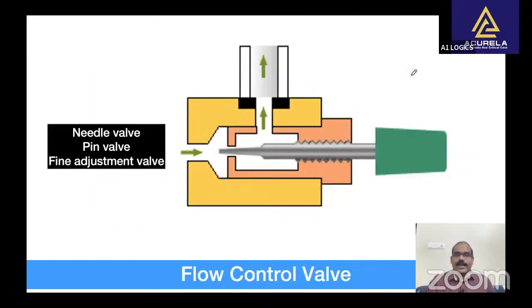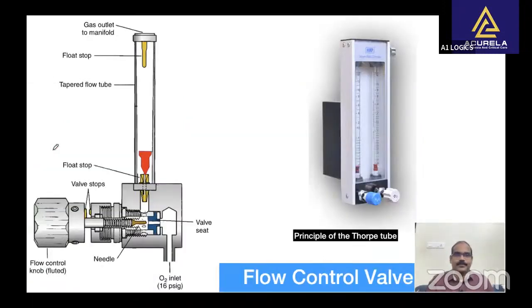Mechanical flow control valve controls the rate of gas flow through its associated flow meter. Mechanical flow control valves are used with both mechanical and electronic flow meters. The flow meters are mounted vertically and usually next to each other in such a way that the upper or downstream end discharges into the manifold.